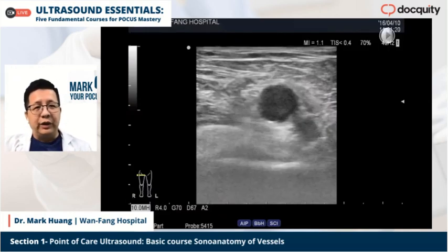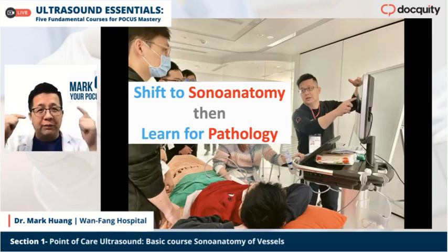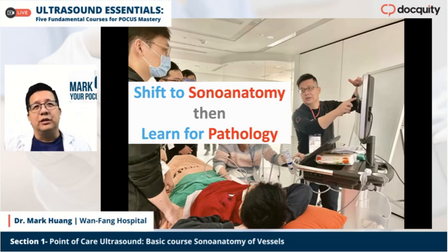Okay, so this is very quick because our major part is anatomy. You need to imagine what kind of echogenicity water has and what kind of echogenicity stone has. You need to transfer your anatomy knowledge to sono-anatomy. Then next time, 2 weeks later, we will learn the pathology.